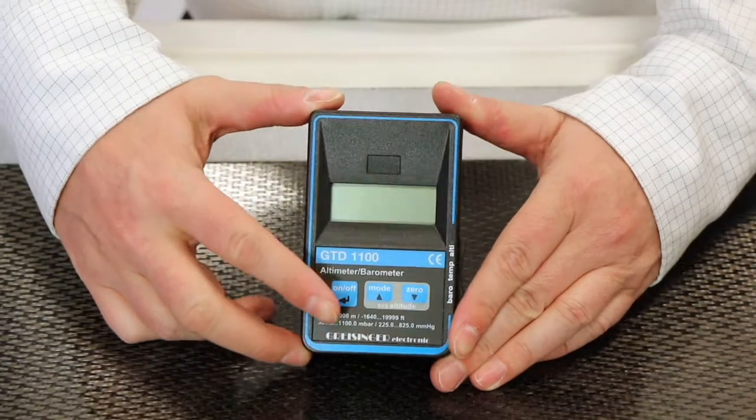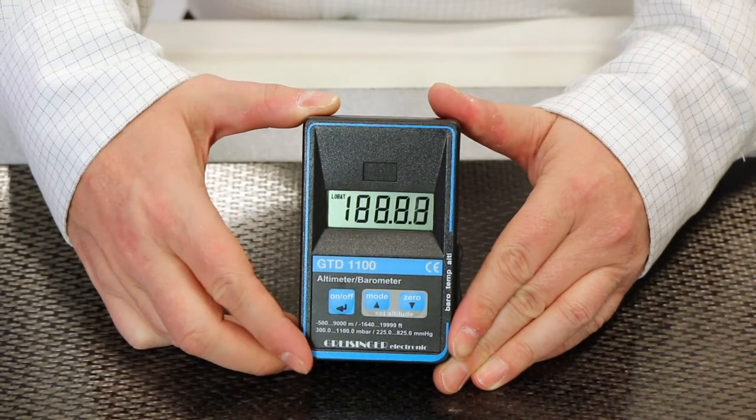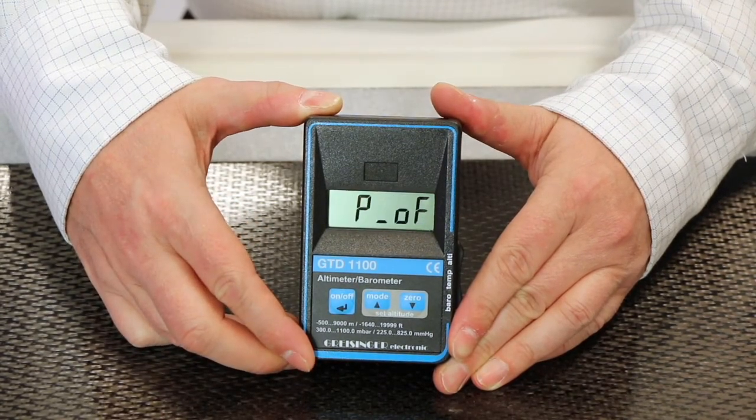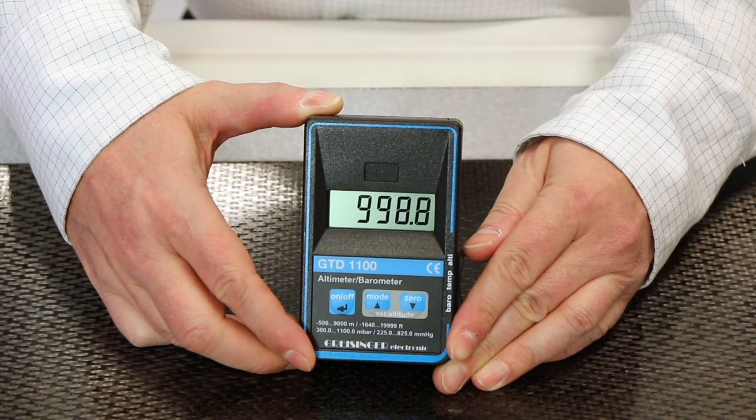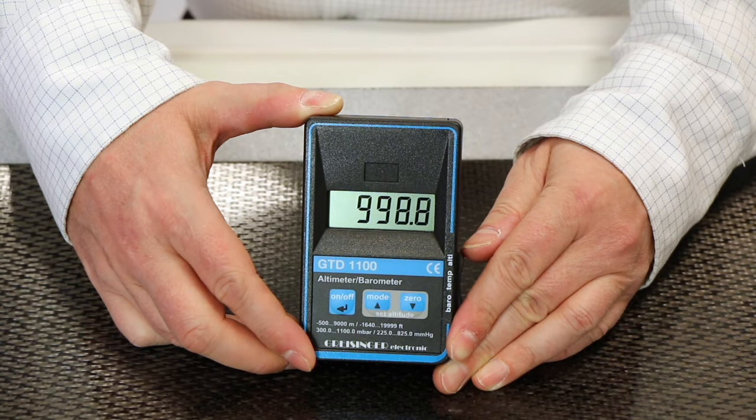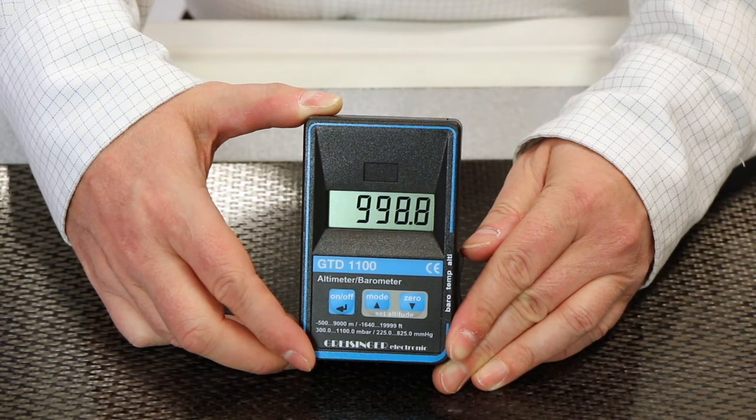When measuring with ion chambers, it is recommended that you compensate for temperature and pressure. Use a digital thermometer barometer to check the environment in your X-ray room. Save this compensation factor for calculating your final measurements.